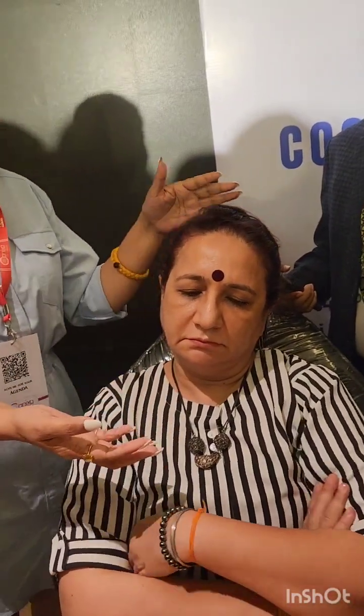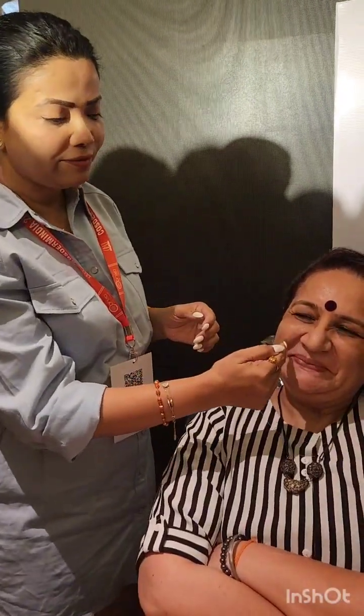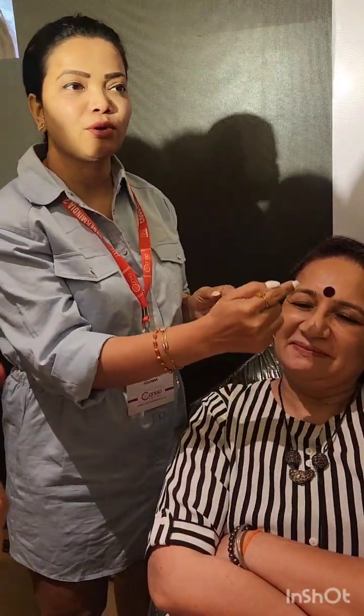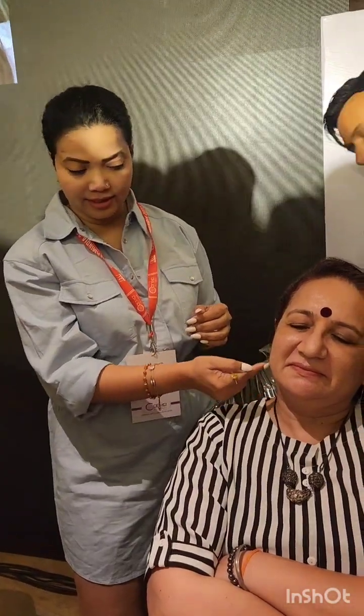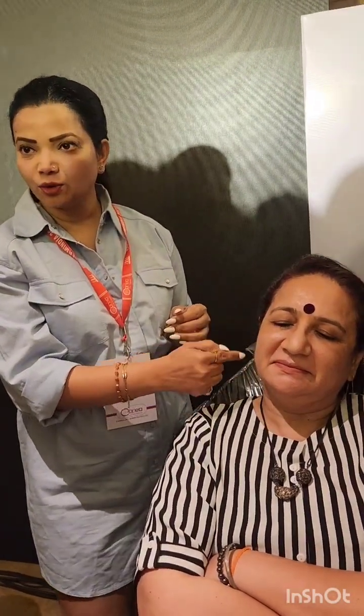So what is vector? Now the question comes, I was coming to that point. What is vector? In her case, what will be the vector? Vector is always perpendicular to the zone of action. What is zone of action? Zone of action is her nasolabial line. Whatever you are treating is the zone of action. Okay? If we are treating the jowl area, this is her zone of action.